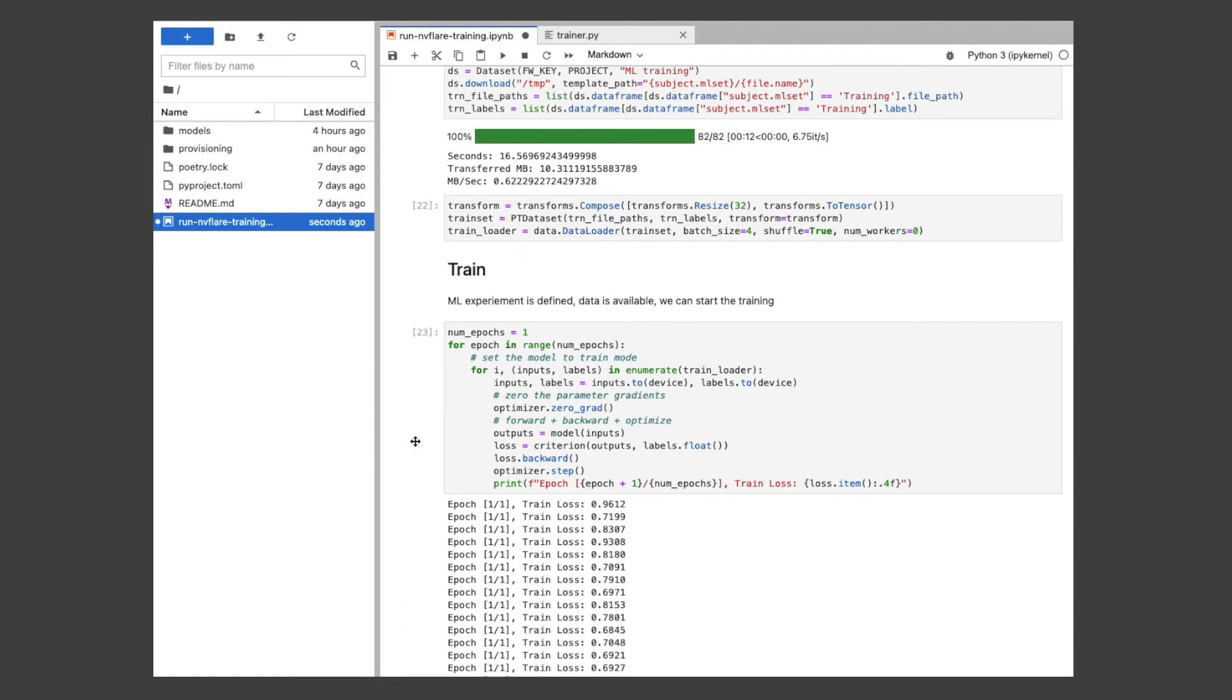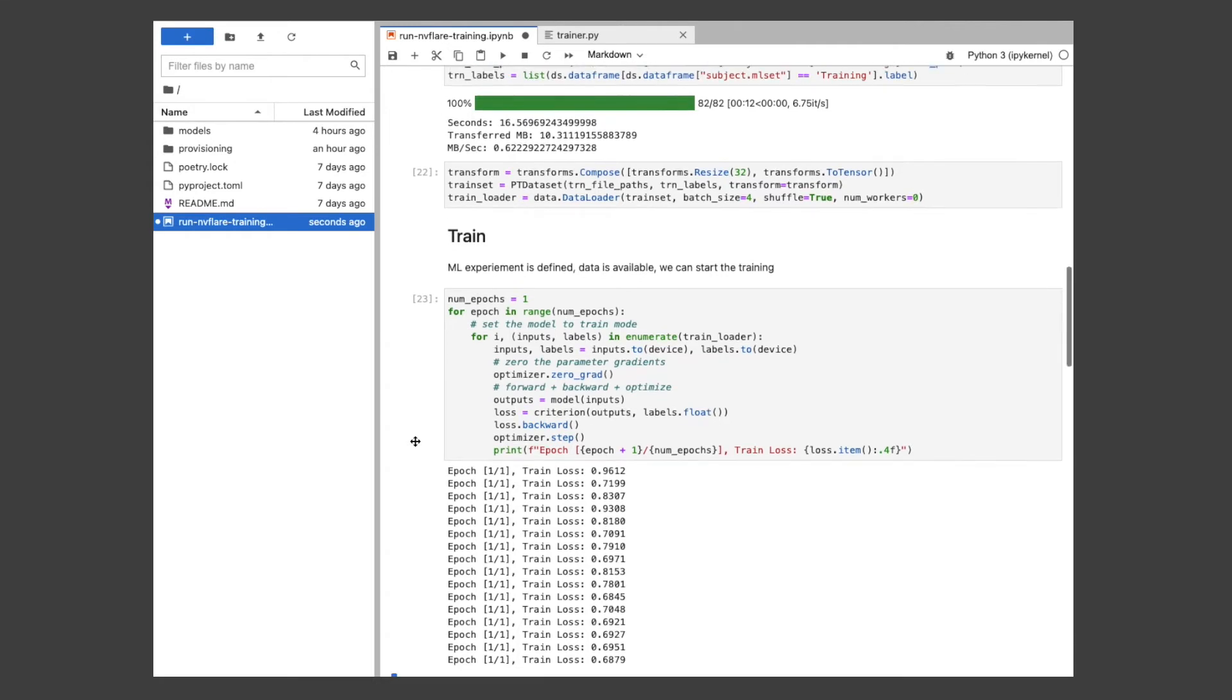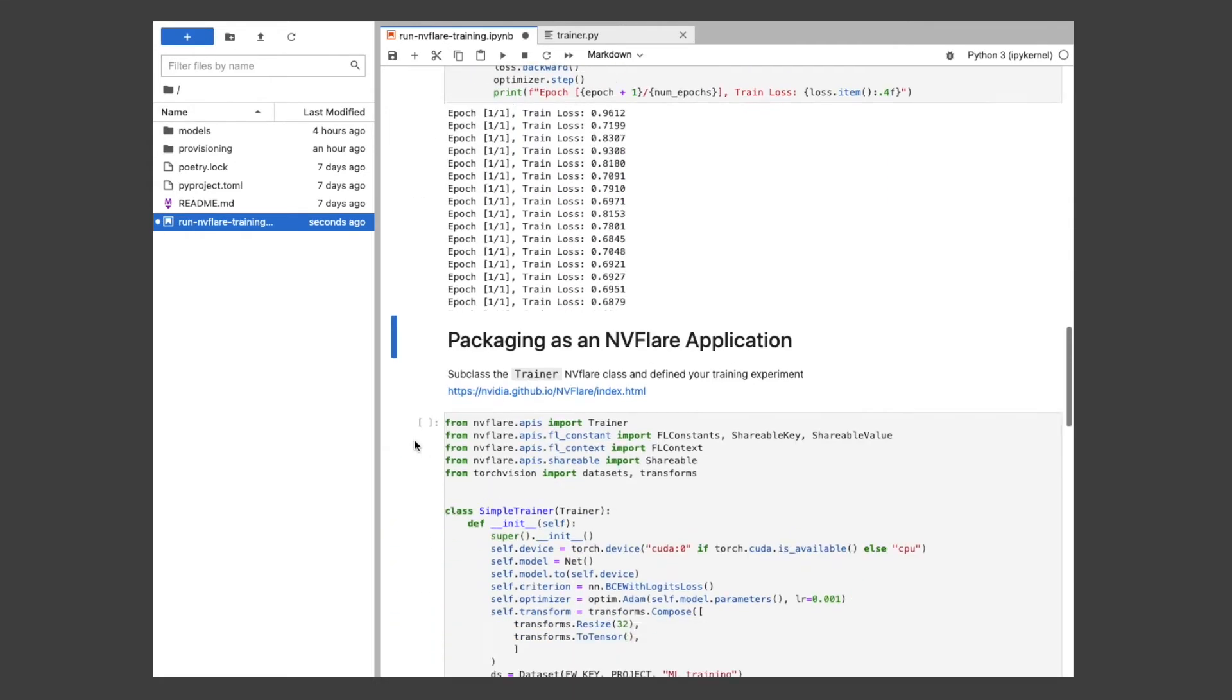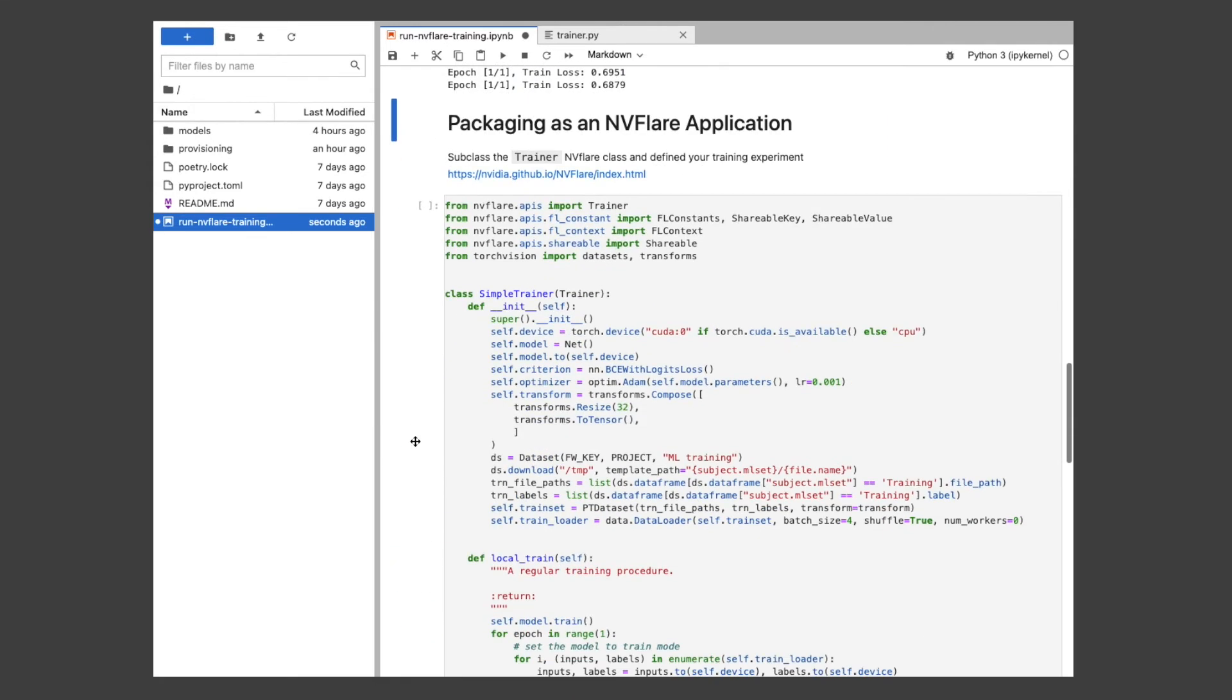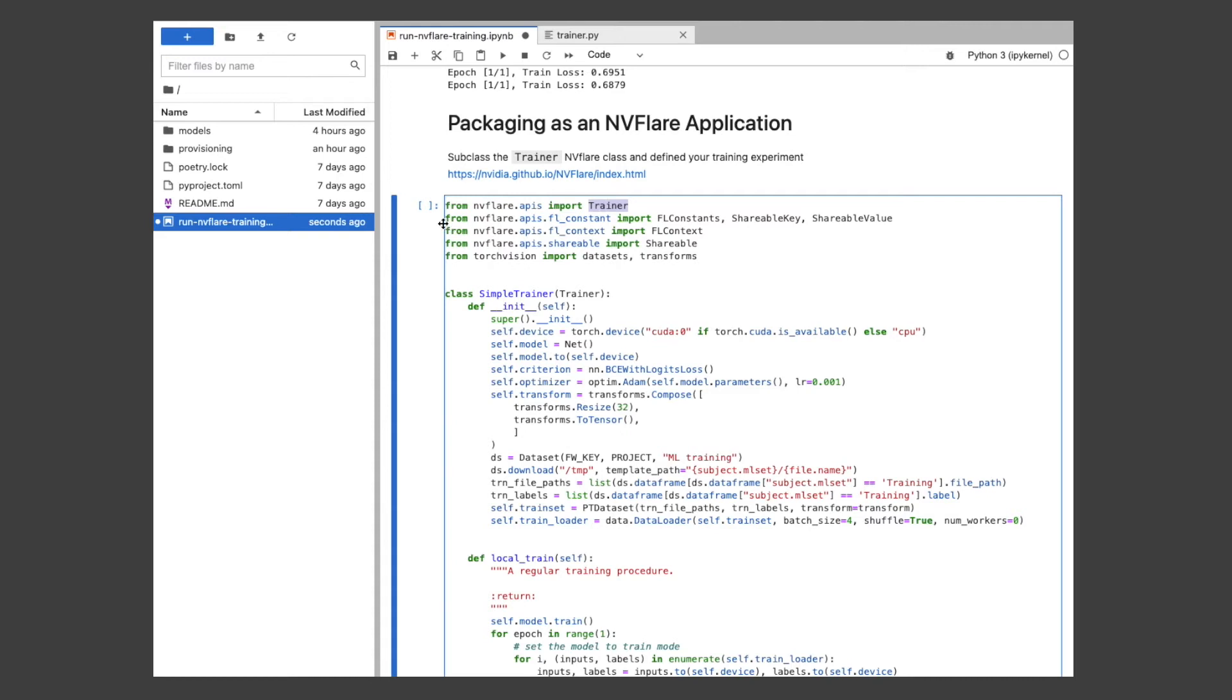Then for this experiment, we ran a simple PyTorch training loop which trains on our image data and updates our model. Now, with our workflow defined, we can package it as a Flare client application.